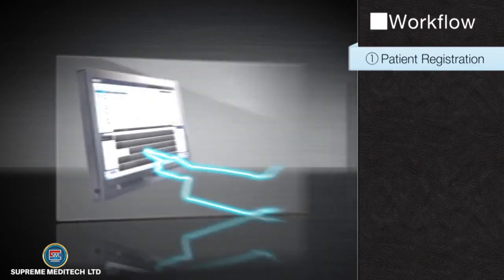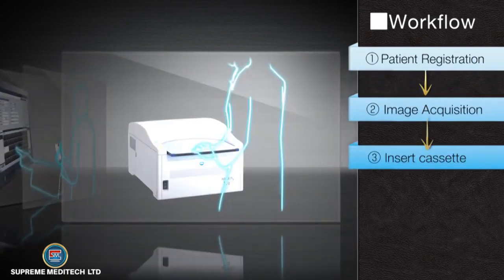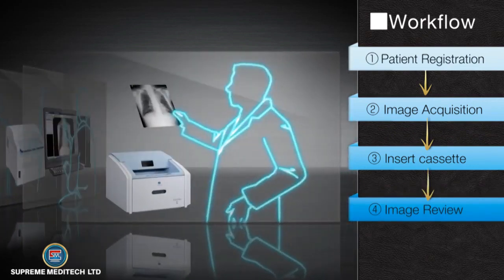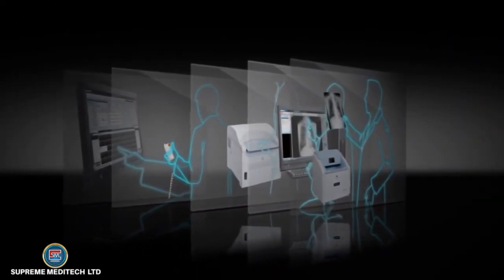The Regis Sigma and ImagePilot all-in-one workflow includes patient registration, image acquisition, image review, and distribution of patient data, and printing to film — maximizing productivity for clinics, imaging centers, and small hospitals.